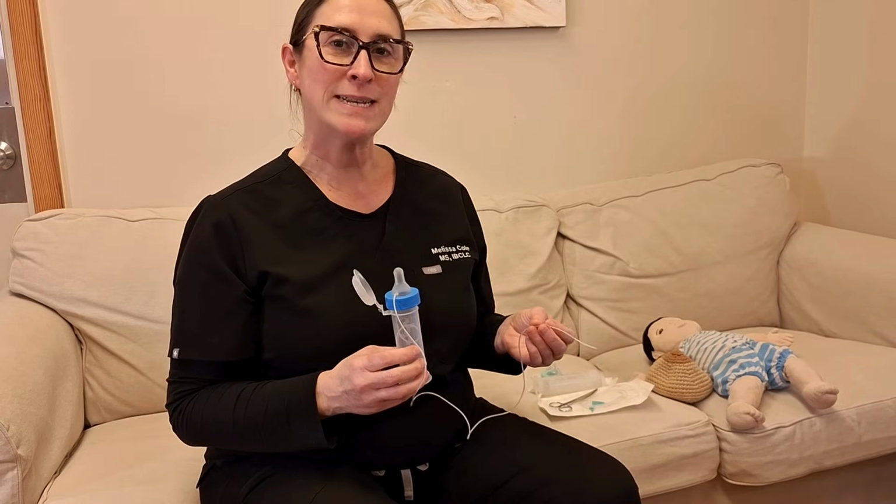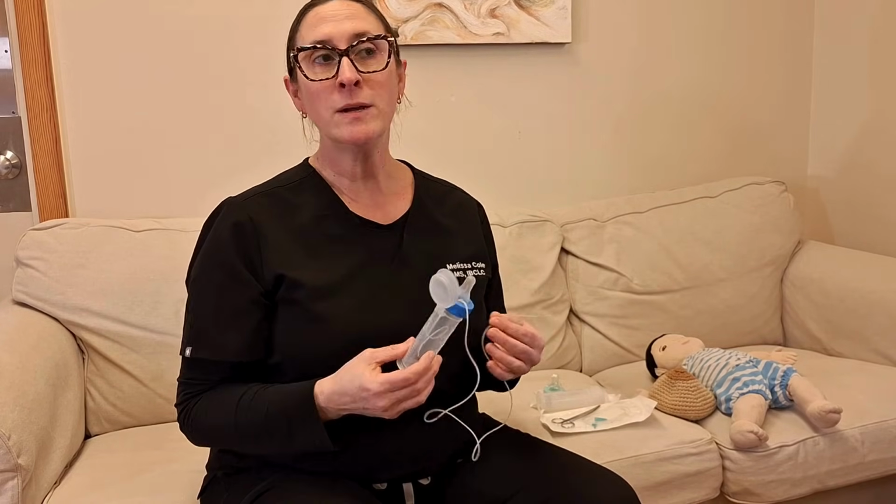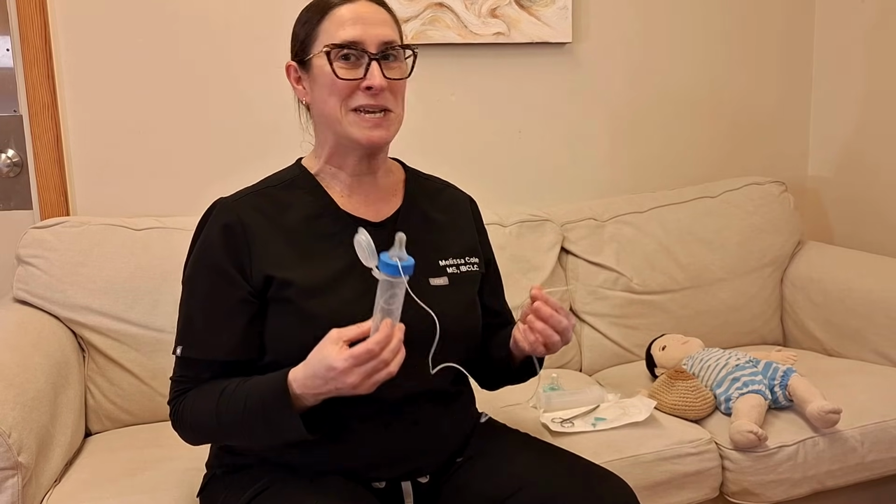I'm Melissa Cole of Luna Lactation, and today I want to show you how to make, use, and clean a homemade at breast or chest tube supplemental system. There are many commercial over-the-counter products, but some people actually find that using a DIY or homemade version can be a bit simpler and more economical. So let me show you a few things.